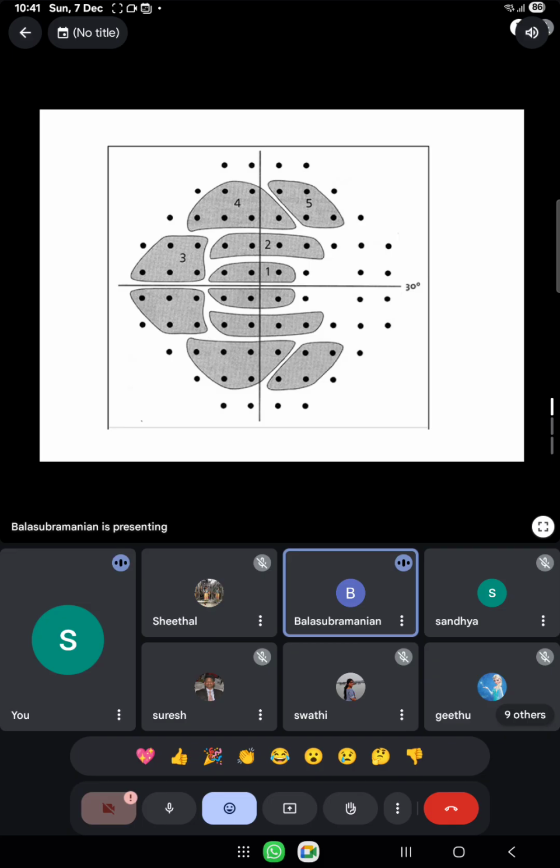So a score is assigned to each zone, based on the location of the zone. Is it a random plot? If they are assigning zones and numbering them, it has a meaning. It has a reason.